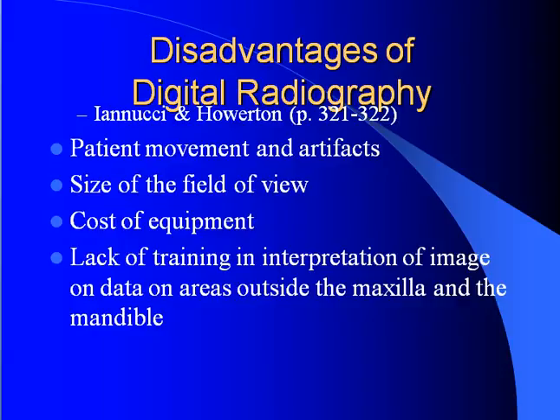CBCT machines currently range in cost from $150,000 to $300,000. Training must be complete to use the equipment properly, as well as training of the doctor in the interpretation of images.